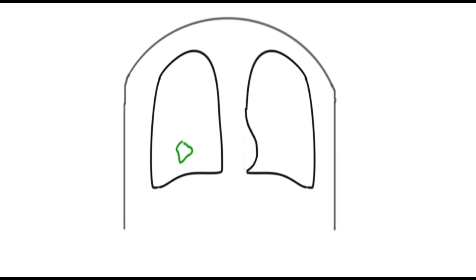You have this GTV, it moves around with respiration. Now I can capture that shape at a particular breathing phase. I load it in from the 4D CT. And then the tumor moves around, and I capture another phase down here, let's say, moves around some more, and I can capture other phases. So I can get as many phases as I want. And they all get loaded in, and then in the end, what I do then is draw a volume that's going to encompass all of them. This is often called the IGTV, the internal GTV, accounting for motion.